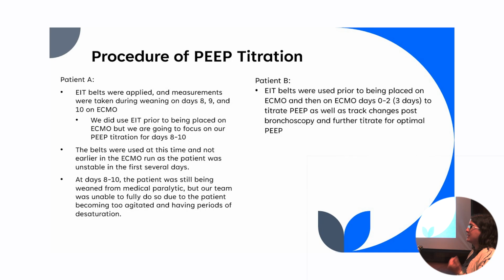During the first few days, they were not doing well. They were very hypoxic. We could not wean our FiO2 or FDO2. We were very labile. We still were on some pressors. They were very sick. Anytime we would turn the patient, they would get tachycardic, and their blood pressure would drop.